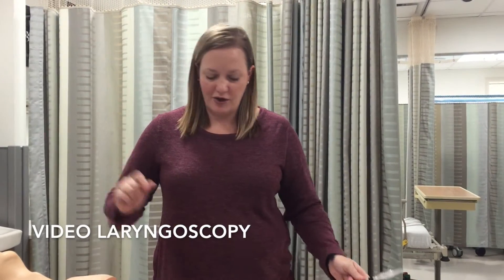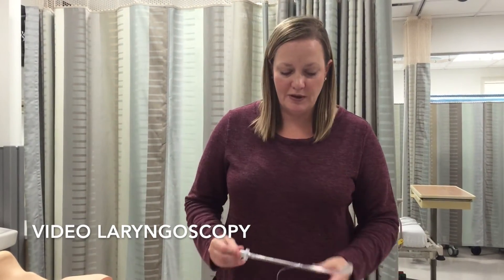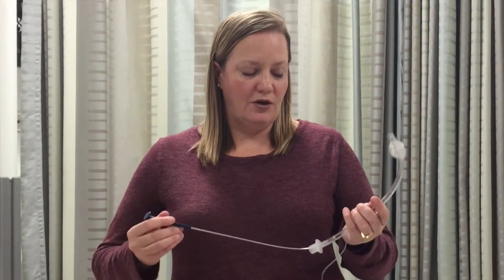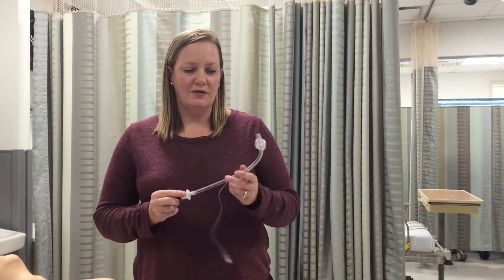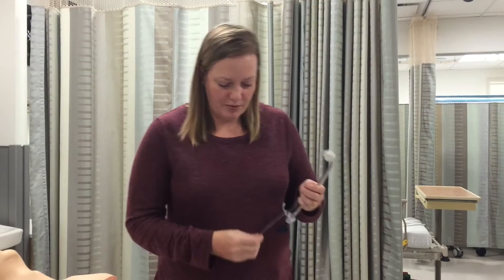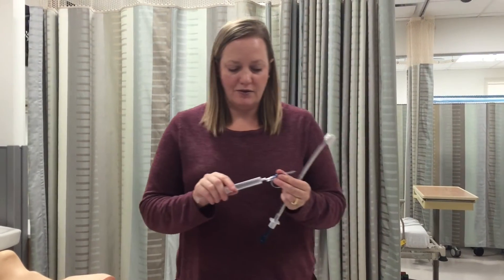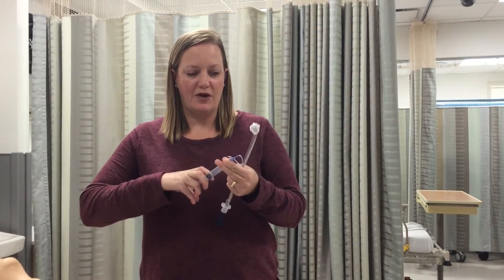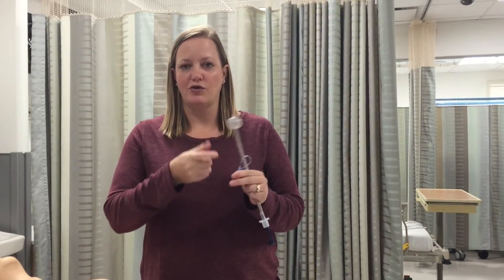We're going to start with video laryngoscopy, or the GlideScope. The GlideScope has a rigid stylet which is necessary for the angle of your GlideScope to work. You place your stylet in your ET tube and you will check your cuff. You'll inflate with 10 cc's of air and make sure there are no leaks.